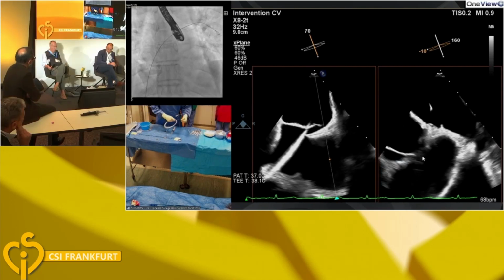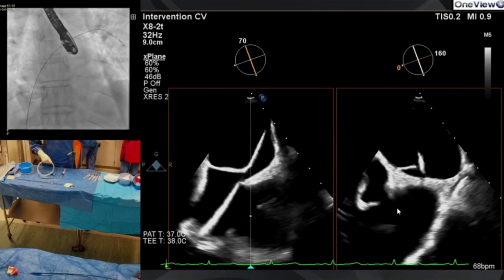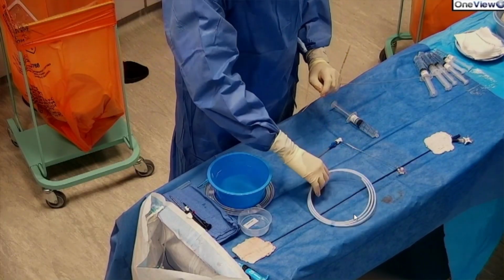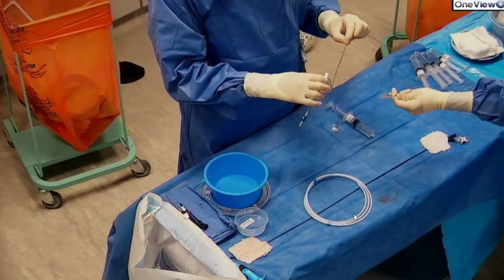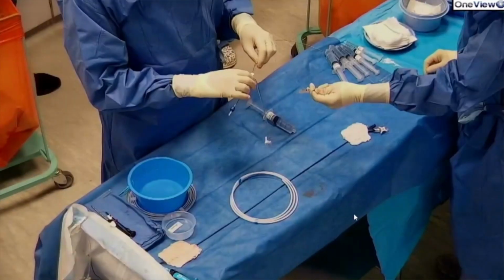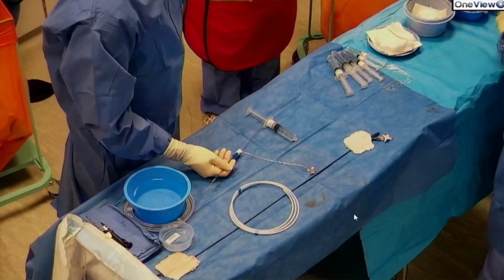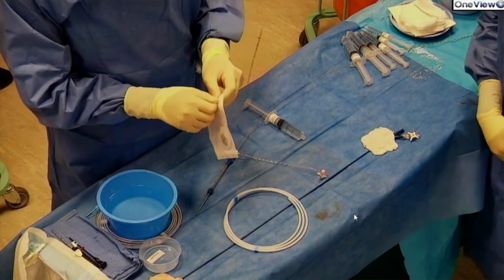So, Henry, if you could just zoom in on our trolley here. The delivery cable is very much like the Abbott delivery cable, and there's a thread and a screw on the end. It just goes through a usual introducer, really, and the device comes in a pack, and it looks like an implanter, eventually.